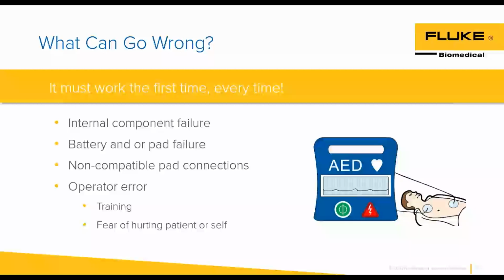In the summertime, we get stuck out on these extended fire calls, and inside that compartment, which is up against our pump, it gets really hot. So that AED isn't exposed to normal operating temperatures like you might find in a hospital. These AEDs and defibs might be exposed to these extremes. Here's another thing: the ones on the helicopters or on the ambulances are going into accident scenes. Accident scenes aren't always nice, warm, dry places. Sometimes it's sopping wet and pouring down rain. These machines can be exposed to all kinds of environmental conditions, even the ones in your hospital.